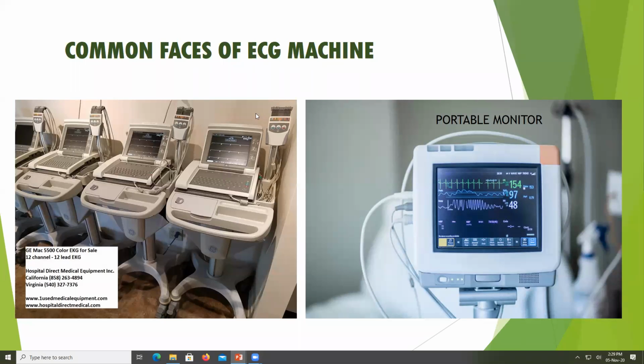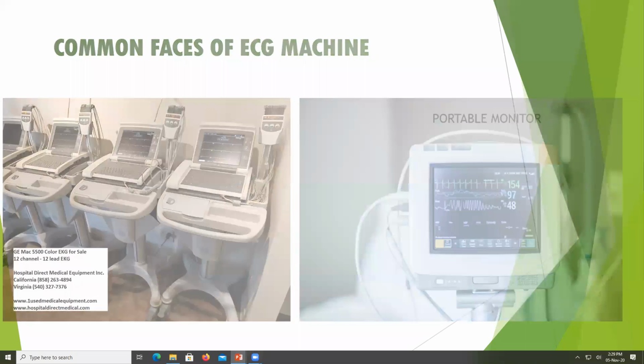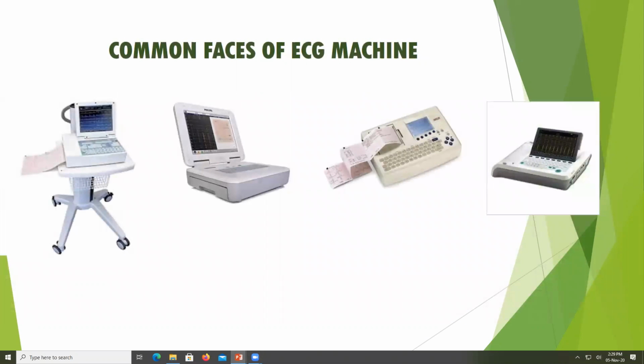And we also have here the brand of these ECG machines, GE. We have actually the same as this machine, but a different brand. We also have this type of ECG machine. Actually, most of the ECG machines nowadays are portable, if not all, but most of them.